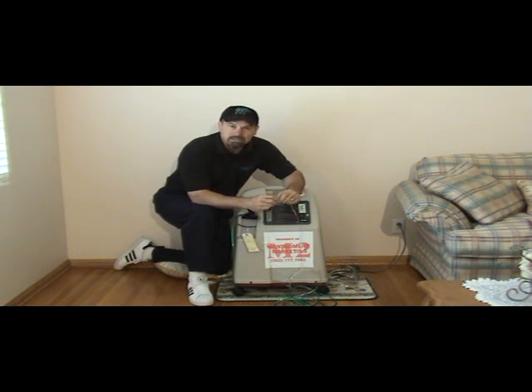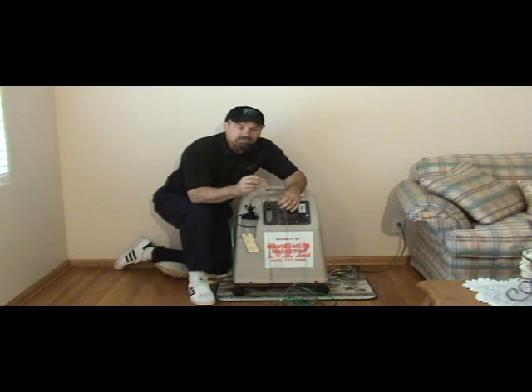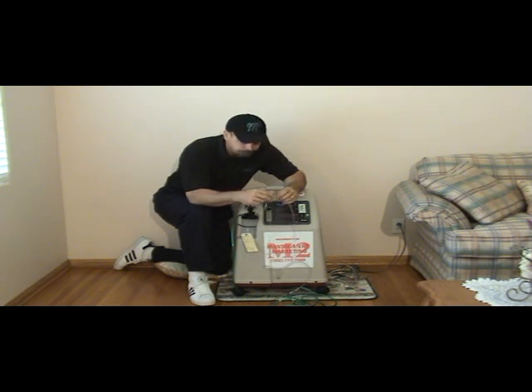Couple things real quick about this, to go over some of the problems that you're going to encounter with these types of things. Number one, as we've gone over, is the humidifier bottle. Make sure it's on square and tight. Do not fill past the maximum level. Another thing you're going to experience is with the extended tubing, you need to make sure that it's set up so that it's not going to be a hazard as far as tripping or anything like that.